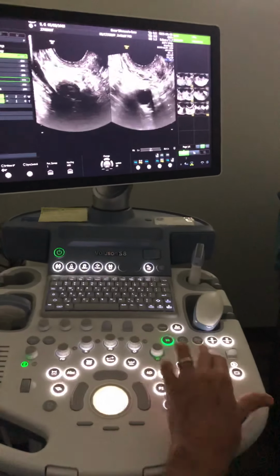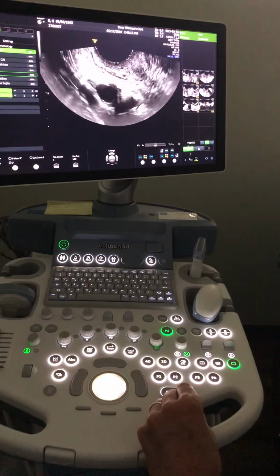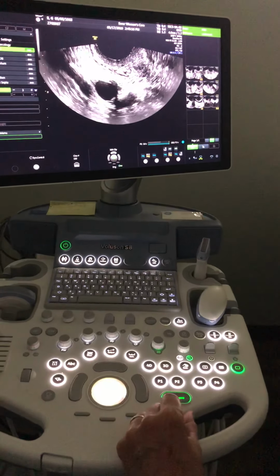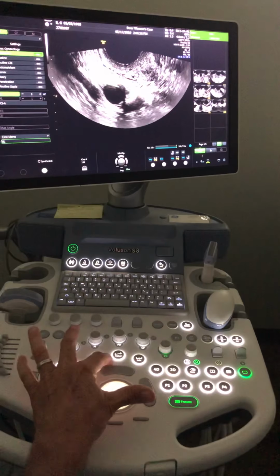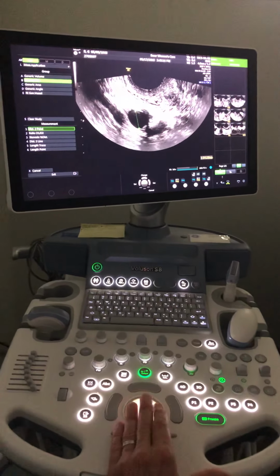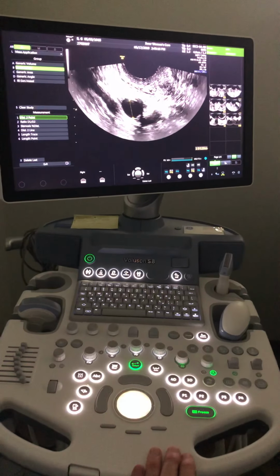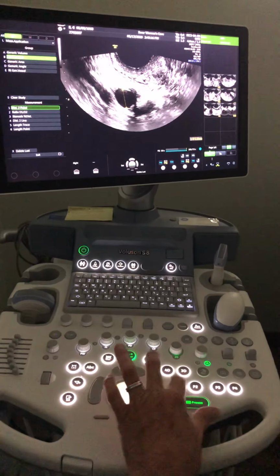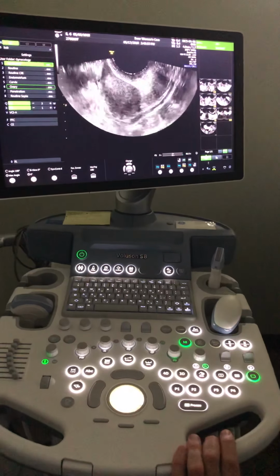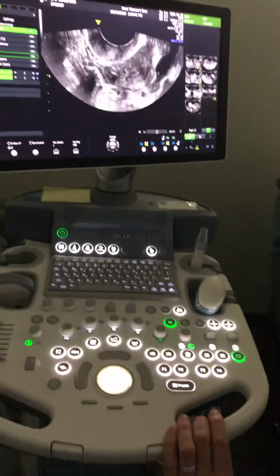And then I'm gonna look closer at the ovary with a single screen, because it looks like there's a simple cyst. And there is. And I'm gonna freeze that. And we'll just do caliper to measure a cyst or any other finding you want to measure. She's got an 11 millimeter simple cyst, and we'll push P1 to record. All right, so that's it. We'll go over and look at the other ovary.